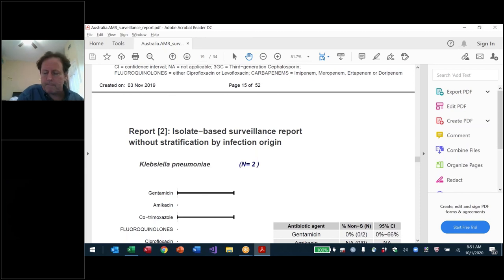with the network people. If you believe that they're doing a relatively good job on organism identification, you can also present the statistics on that. They found 20 E. coli, they found 100 staph, they found so many staph in blood, so many staph in urine. And then the antibiotic results. If you don't believe their antibiotic results, don't include them in those tables. So the answer to your question is, in the ideal world, we would have every laboratory in every country participating in their national program. But it depends on their desire and their willingness.